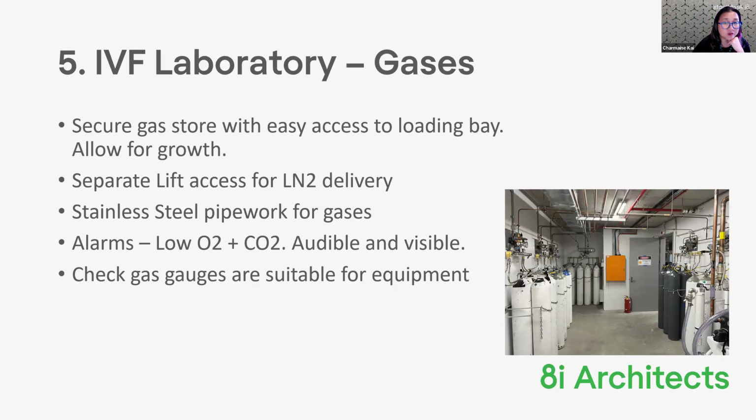Gases. So you need gases in your IVF labs. To have a secure store with easy access to a loading bay is important, because you can then get really efficient swapping out of your gas bottles, and make sure your gas room allows for growth. So you have enough manifolds, or you can easily add manifolds. Generally, most of the bigger lab gas stores are separate from the lab, and I would encourage that to be the case, simply because of deliveries. You don't want delivery people coming into your lab space.